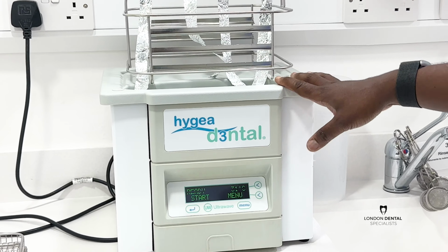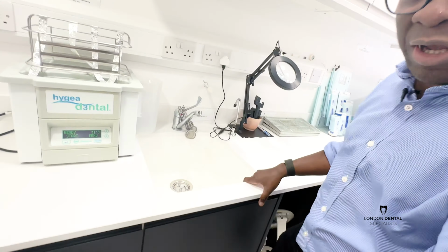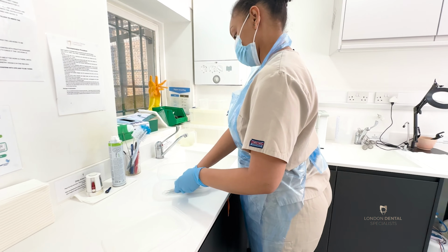This is a dental dishwasher. It's an ultrasonic cleaner. This sink is for instruments that have been through the ultrasonic, through the dishwasher. They come in here to be rinsed, and then they go into our sterilizer. So we'll show you one step at a time how we clean the instruments. These are just some examples of instruments that have been used, but we want to show you exactly what we do for the dirty instruments.